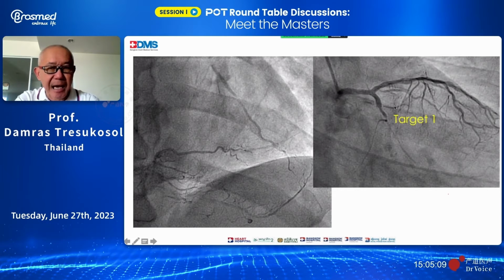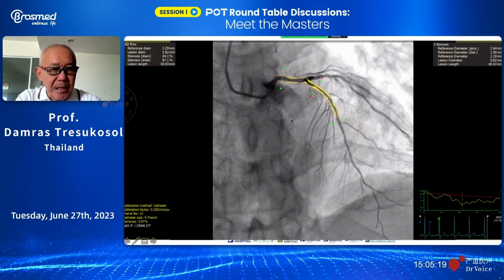And this is the angiogram of the left coronary artery. You can see functional occlusion of the circumflex around here. And there is diffuse disease on the LAD. This is the diffuse disease of the proximal to mid LAD.